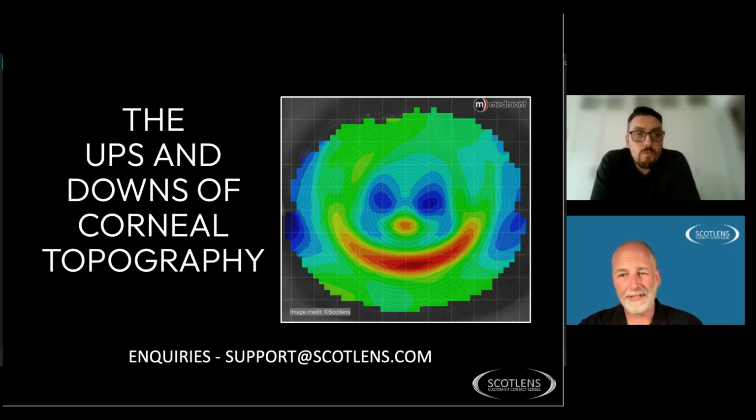He's not really after the night lens. Fitted him and coached him. I was quite open about the fact that he would maybe need a bit of help reading. Actually, he's now in his 60s, and he only has a set of +1s he wears occasionally. So he's got a distance center multifocal cornea, and it works effectively that way for him.